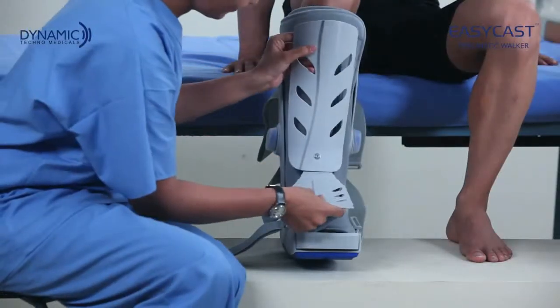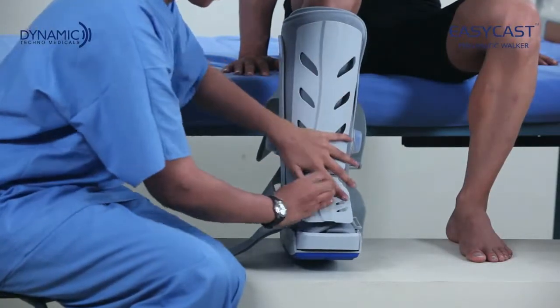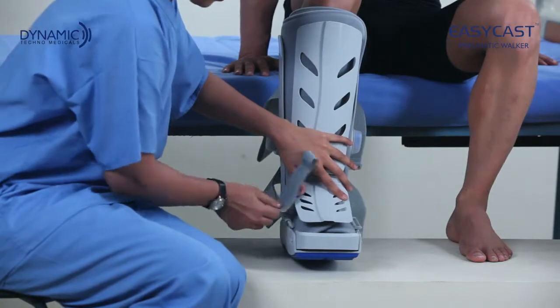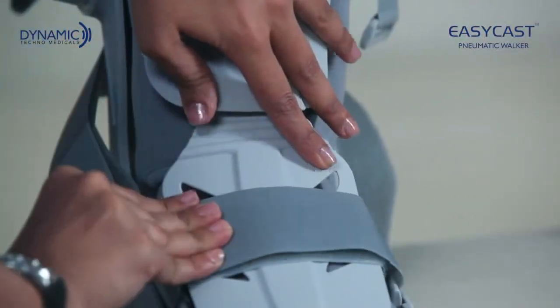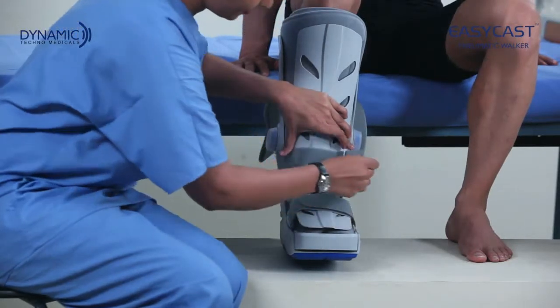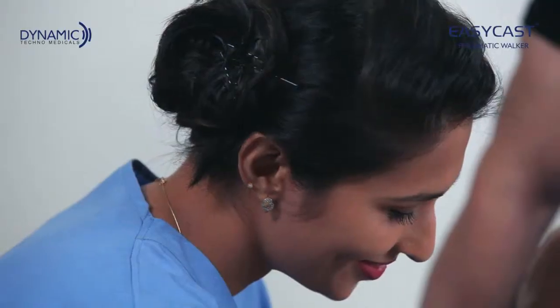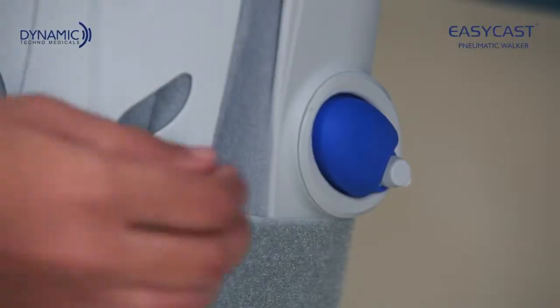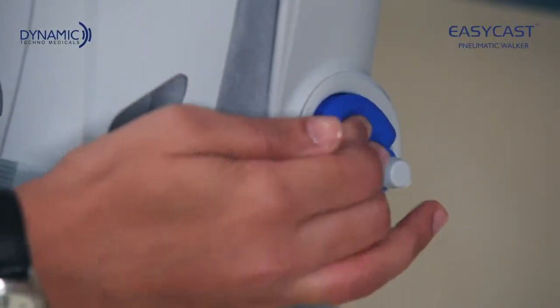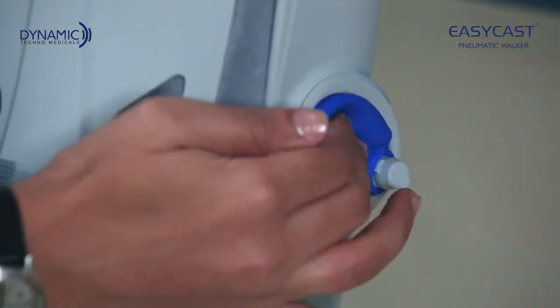Place the front panel over the foam lining and fasten the straps from bottom to top. Gently press the inbuilt inflation pumps on both sides until it is comfortable.